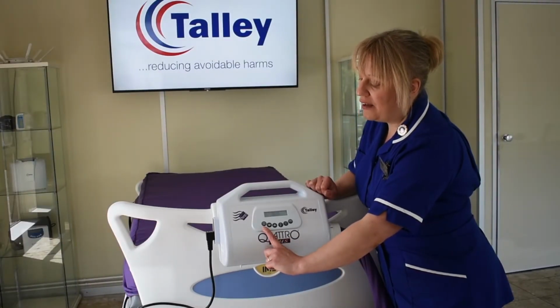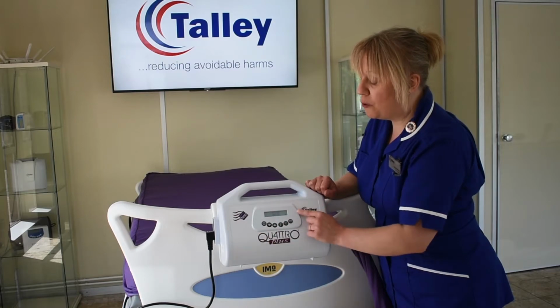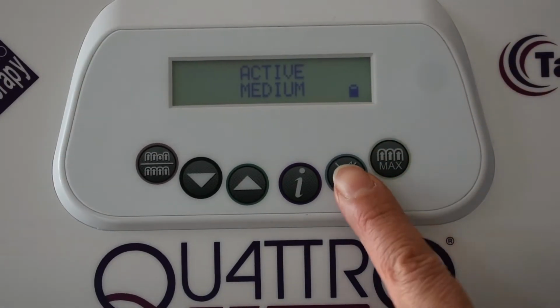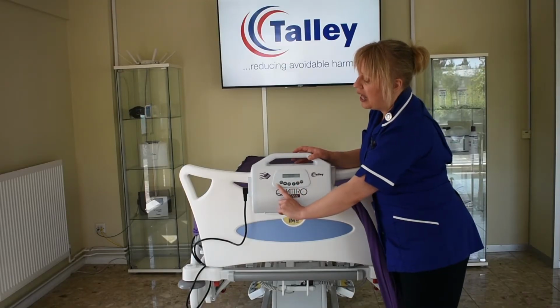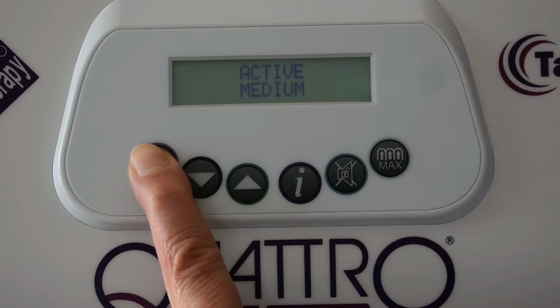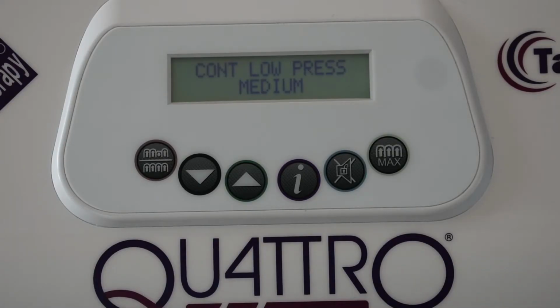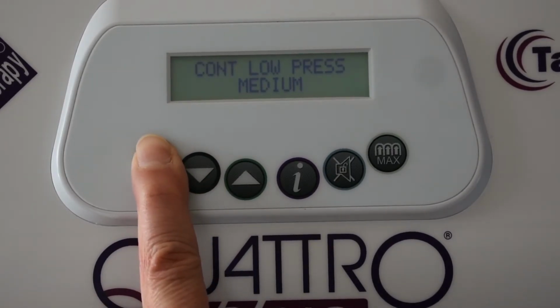The button on your far left as you're looking at the screen is our therapy mode button, and that will change your power unit from active to something called continuous low pressure. Continuous low pressure is a soft static mattress. To change it over, we're just going to unlock our power unit first of all because it's locked itself. So press and hold down that dual function button, and then press and hold down the far left button until it beeps, and that will change our setting from active to continuous low pressure. Once again, they still have the same comfort settings of soft, medium and firm. To change it back, just do exactly the same thing. We're going to press and hold down the button until it beeps.